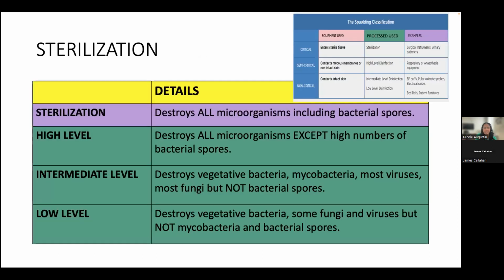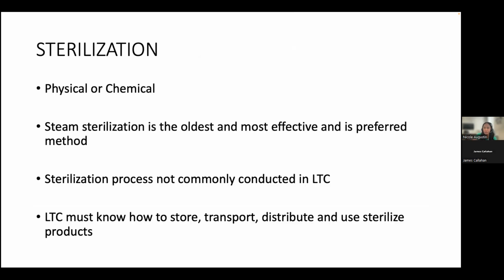Let's bring back this table. Again, sterilization destroys all microorganisms, including bacterial spores. And again, sterilization, you use it on equipment that enters sterile tissue that are considered critical. Sterilization can either be physical or chemical. Steam sterilization is the oldest and most effective and is the preferred method.